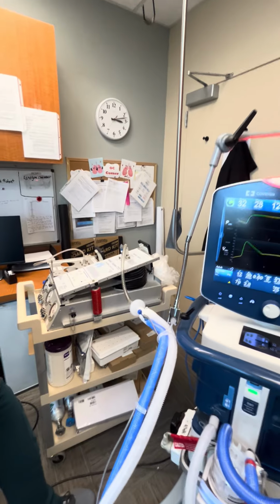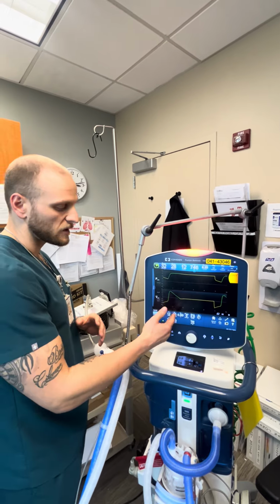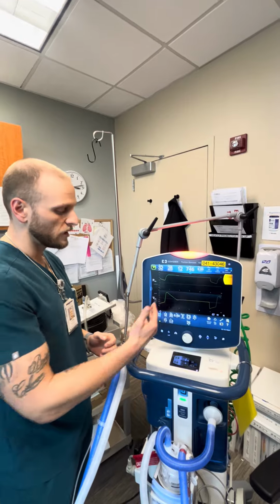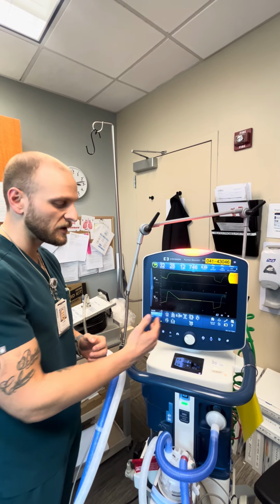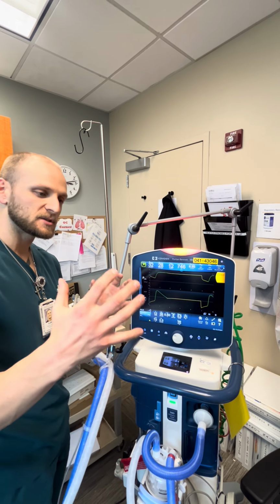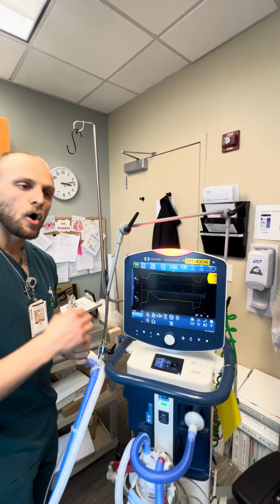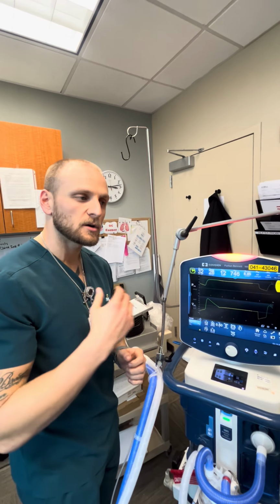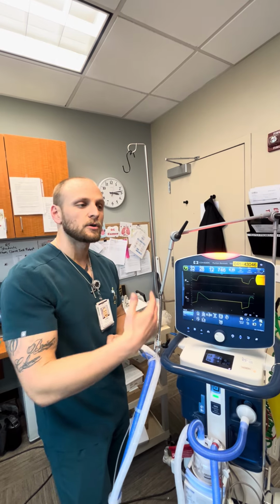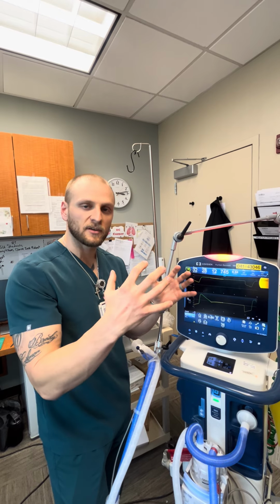Okay? Now, once your patient's on your settings, you know that we're at the appropriate pressure because we got that from our plateau pressure, right? We know we're at our frequency times. We know our P low never changes. What's the one thing we need to adjust to optimize our lung expansion is going to be our T low. On your badge buddy, it's going to reference your peak expiratory flow rate and how long you need to set your T low to reach a goal of 75% of that.